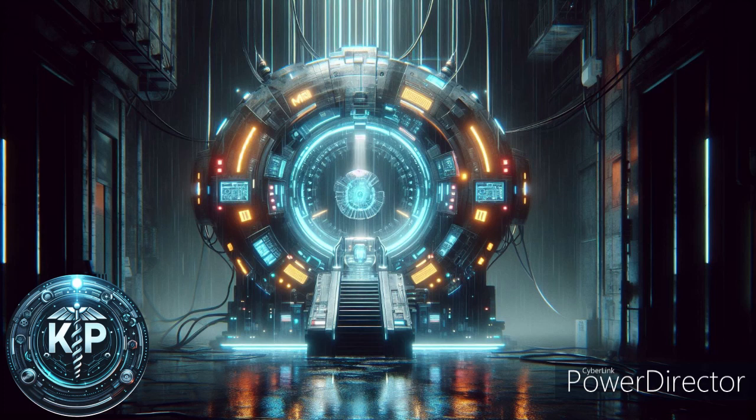RF power amplifier. This component amplifies the RF pulses that are sent into the patient's body. The amplified RF pulses are necessary to flip the spins of the hydrogen protons in the body to the correct angle for imaging.